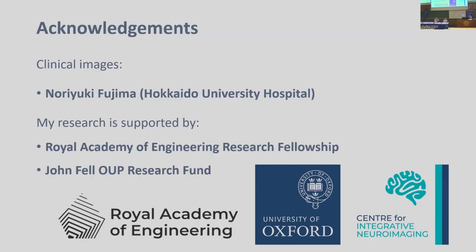Yes, ASL angiography is unlike contrast-enhanced angiography. We don't need to acquire one single image in one go, like a real-time dynamic. So we can split it into a segmented acquisition. Of course, if we want both spatial and temporal resolution together, then scan time will be longer, but it's still kind of flexible. So I think that's also one of the very important advantages of ASL angiography.